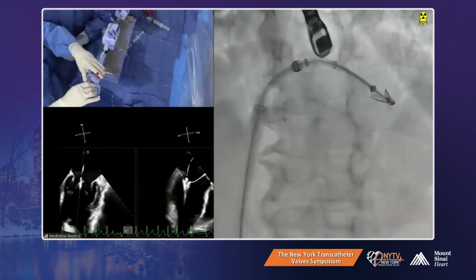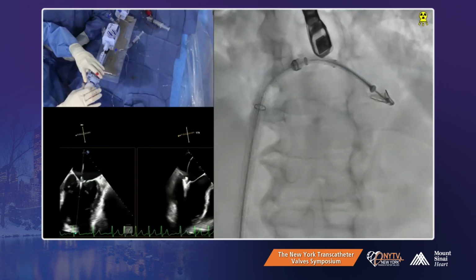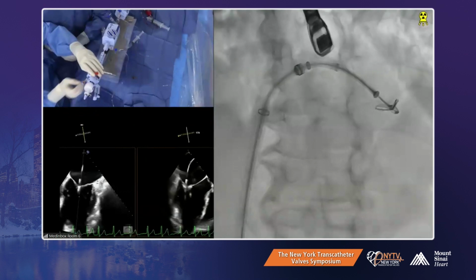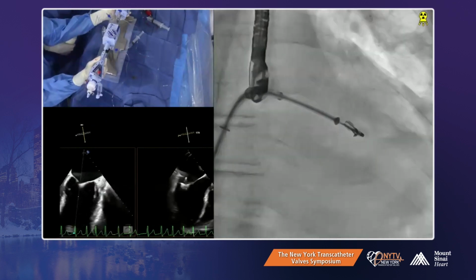Posterior is off. Oh, we lost the posterior already, so we can see that. Howie, you've been saying from the beginning that you think they grabbed the cord on the posterior, and that's why the posterior leaflet's buckling and not going in all the way. And the fact that you lost it tells me that you didn't have a good grasp on the posterior leaflet. Go back to Ariel. So would you just release, pull out, and start over?